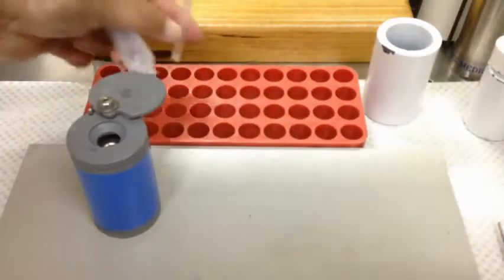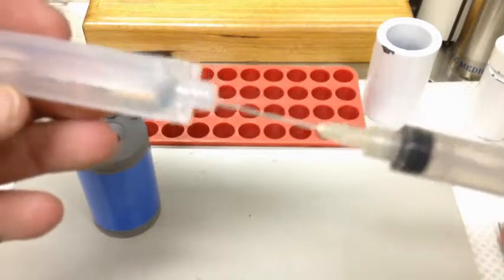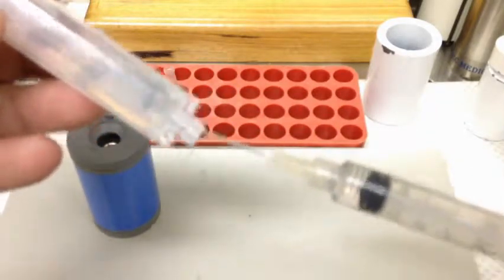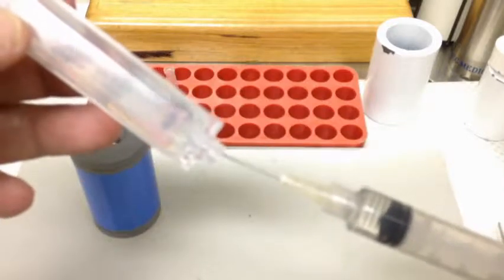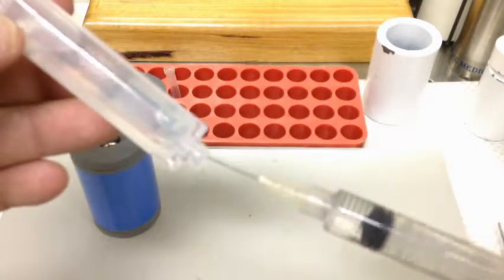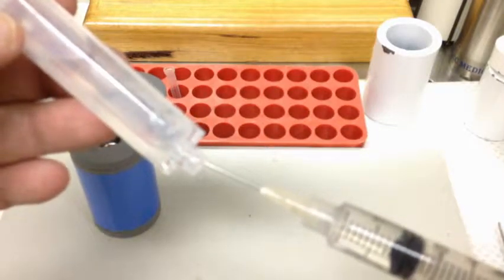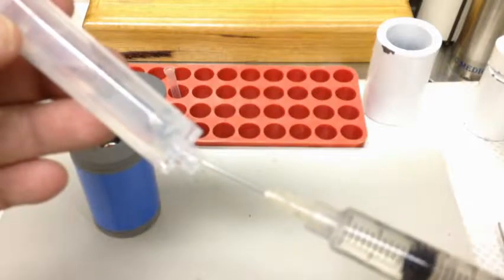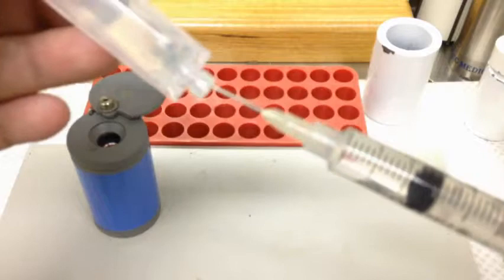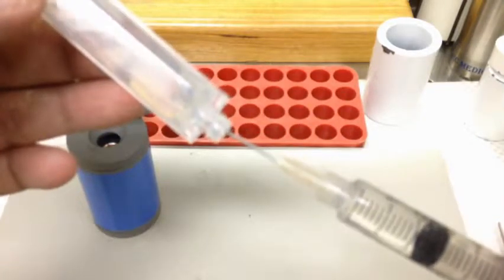That goes in the bin — we don't want a messy workstation, so everything goes in the bin as you do it. We take our needle cap off. When we do our saline, we need to be mindful that an air bubble is going to go in. So this time I have it at an angle and I've got the needle tucked into the edge because I'm going to draw up to 5 mils. I don't want to suck any air in and create an air bubble unnecessarily. So we're going to draw that out to 5 mils.